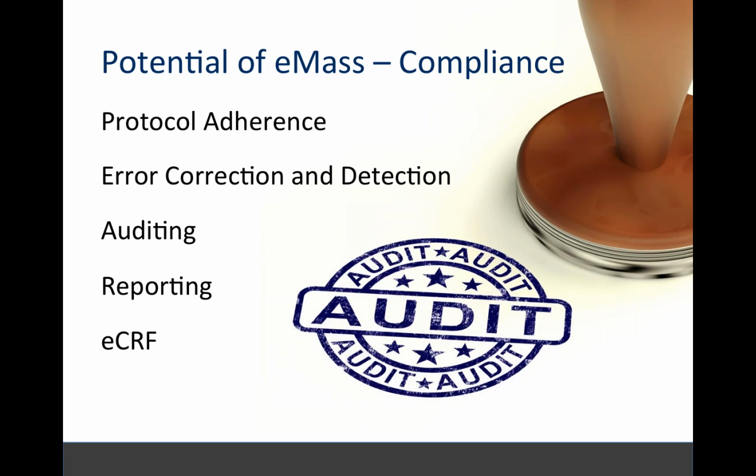Well, I'll say something again that Amit and I gave a talk last week at the Imaging and Clinical Trials Conference in Philadelphia, and I'll say what I said there because I think it got some people's attention, right? If you are using a radiology diagnostic PACS system for doing your image analysis in clinical trials, you are not in compliance with 21 CFR Part 11. I've been in that space. I have yet to see a system that is technically in compliance with 21 CFR Part 11. When you look at something like eMass, it aids in your compliance. And that's just one other thing you don't have to deal with, right? Because you've got enough challenges trying to get through all the other hoops. Don't worry about the compliance you have in imaging.